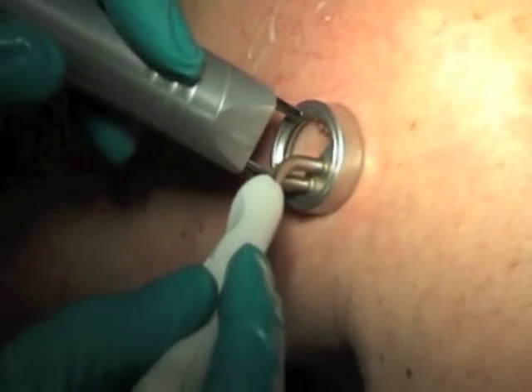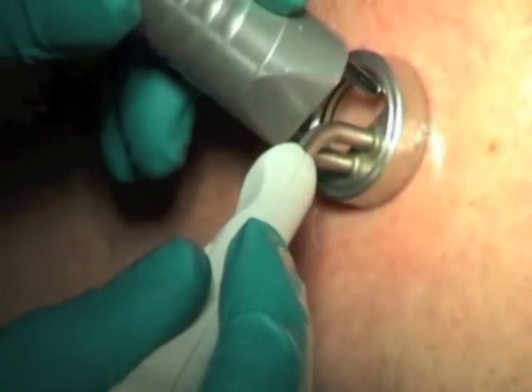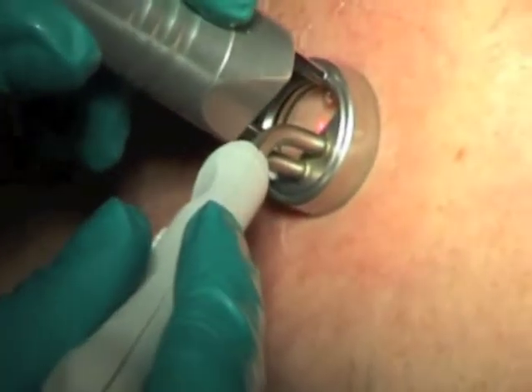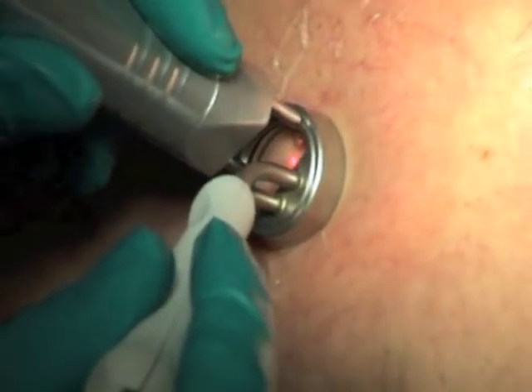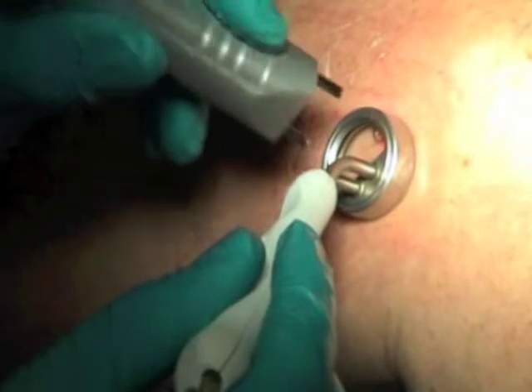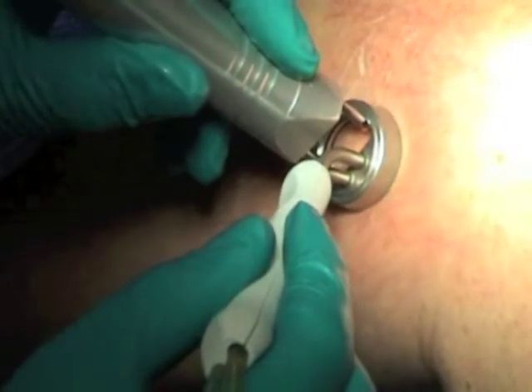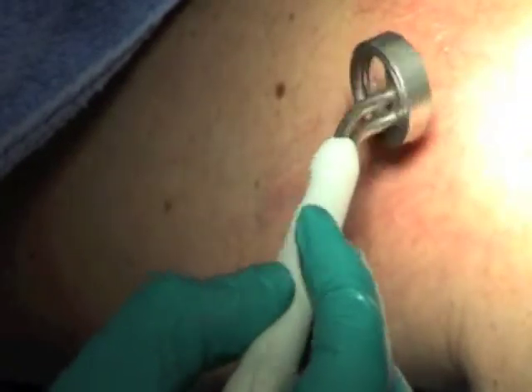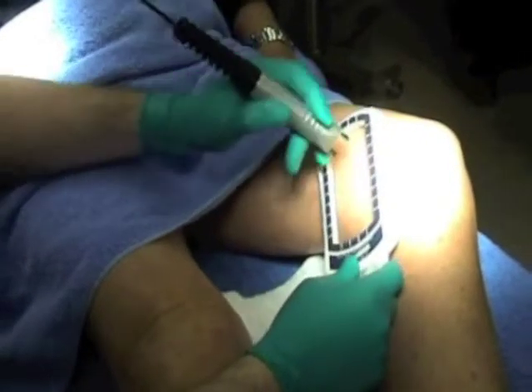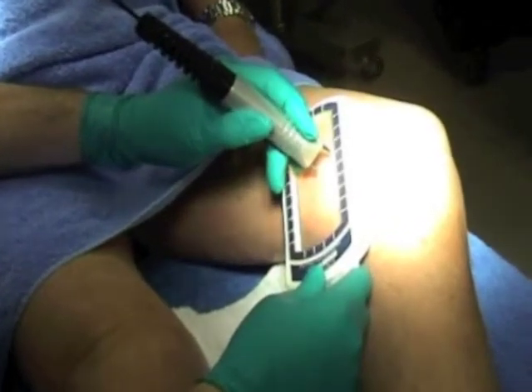You put it along your vessel and you work like that. What I now also do is put this on my handpiece and I am sliding my handpiece over the skin, following my vessel. So I'm not doing it point by point — I am sliding with the whole system across the skin. That's one manner in which you can work. You can also do it with the other system, the big sapphire.